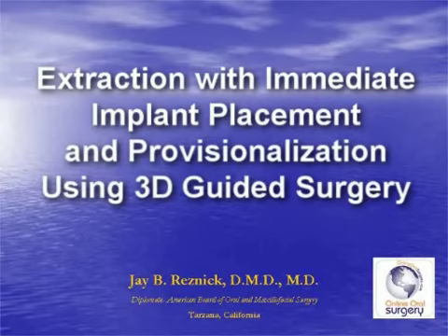And a few years ago, I started using 3D guided surgery more and more in my implant practice, and then having added a cone beam CAT scanner to my office has really made a tremendous difference in the way that I do implant surgery now. Currently, probably about 85% of the implants I place are done using 3D guided surgery, and probably that percentage will increase as time goes on because, as you'll see, the benefits of 3D guided surgery are increased accuracy in implant placement because you know what the anatomy is in 3 dimensions, facilitated surgery because with a guided stent there's no guesswork at the time of surgery.